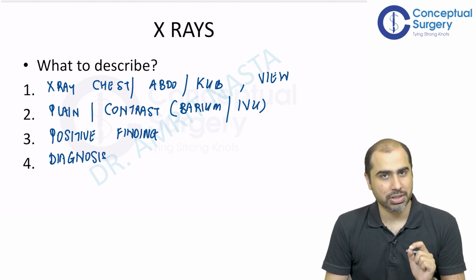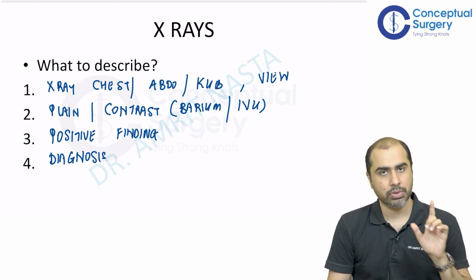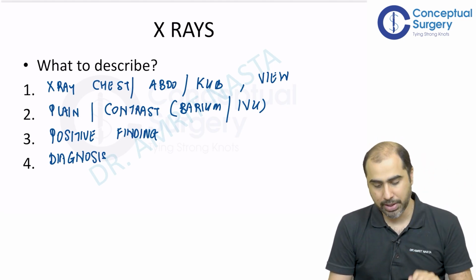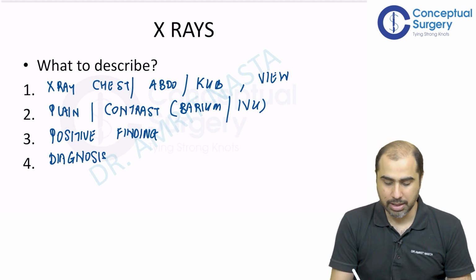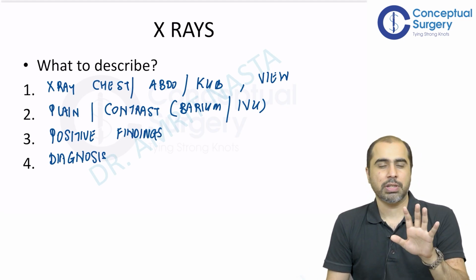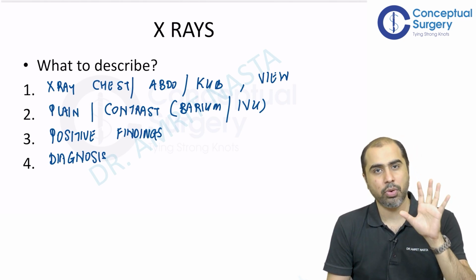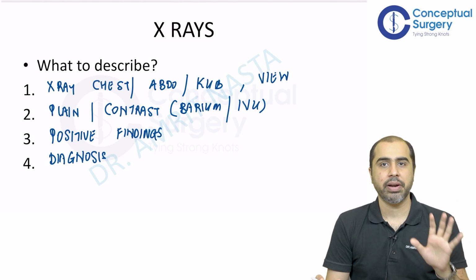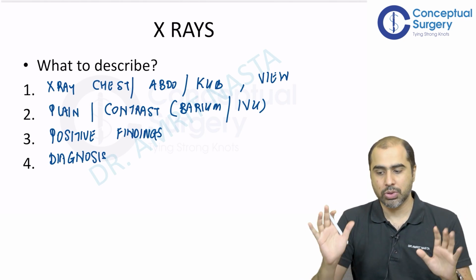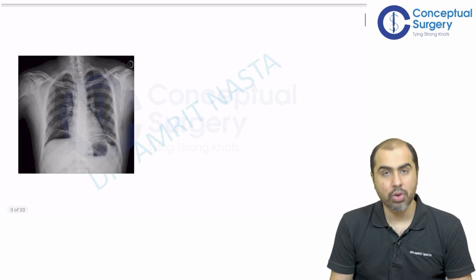Surgeons don't have the patience. They want you to come to the bottom of the situation. So please come to the key, right? So tell the positive findings unless you are buying yourself time. Examiner will catch it. Okay, so which is why it's better to go prepared. There are some standard X-rays which I'm going to discuss with you. You should be able to identify them comfortably, right? So let's get started. Let's show you how these X-rays are and what you are supposed to look for.